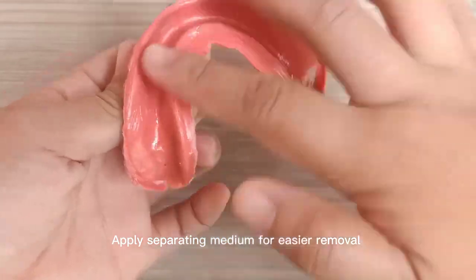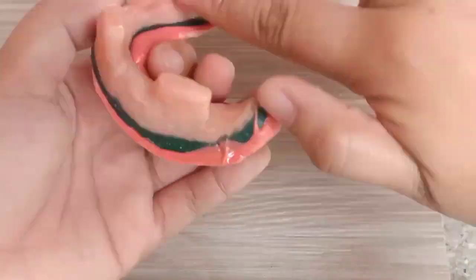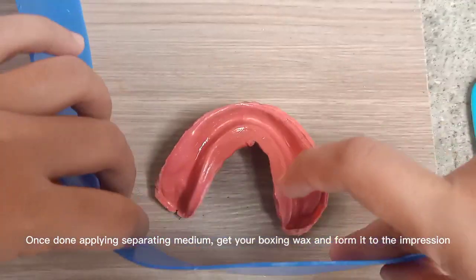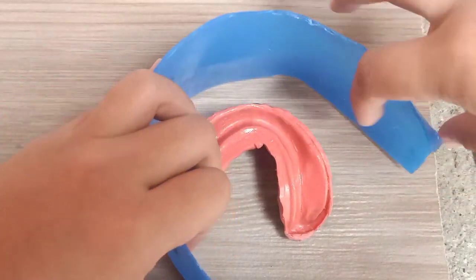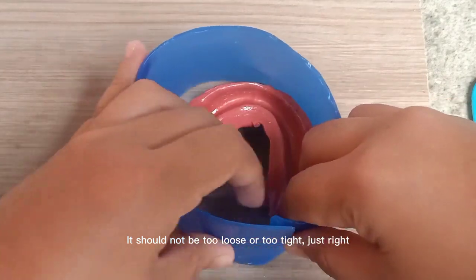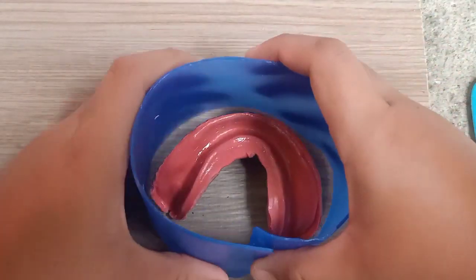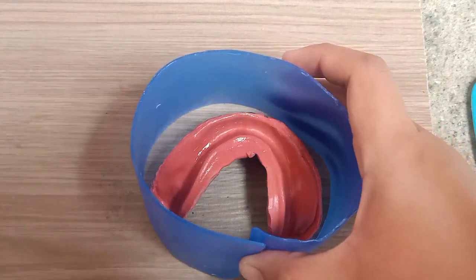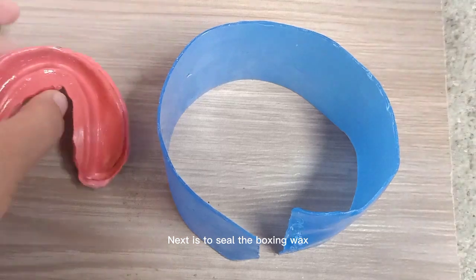Apply separating medium for easier removal. Once done applying separating medium, get your boxing wax and form it to the impression. It should not be too loose or too tight, just right. Next is to seal the boxing wax.